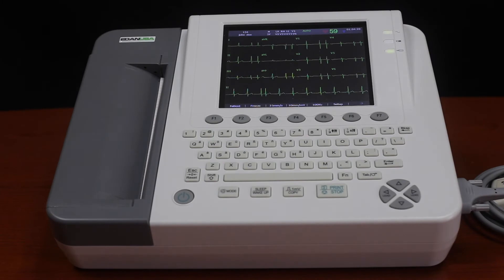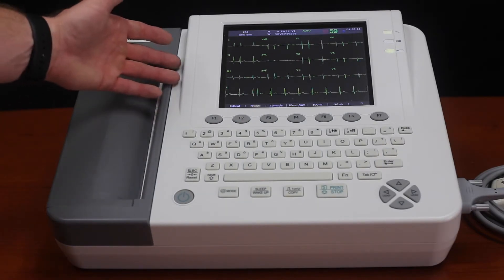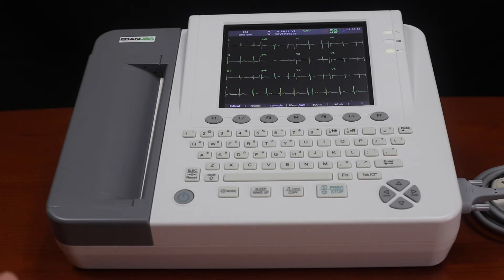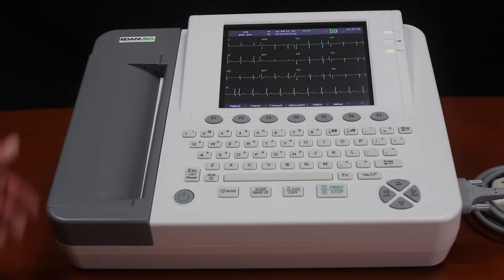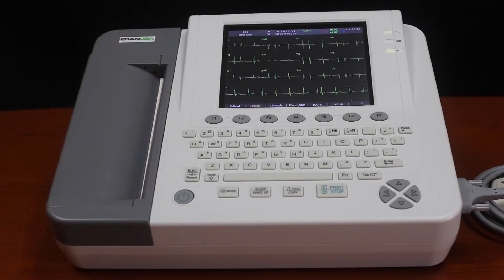Today we're going to look at the Eden USA SE1200 Express Basic EKG machine. As you can see here, there's an eight and a half inch LCD display that displays all 12 leads available. We do have a full built-in printer on board that does a full page printout of all 12 channels. We have a full QWERTY keyboard here to make it easy for inputting patient information.